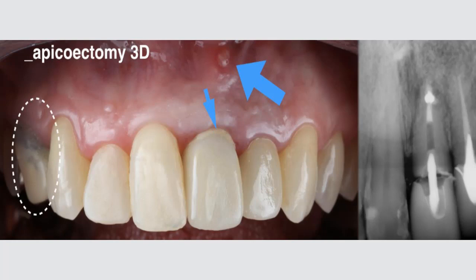When I show this initial slide, I know that we have several dental works to be taken care of for this patient. But there is one infection, which the blue arrow shows us here on the top. So we have an abscess that is coming out and needs some intervention.